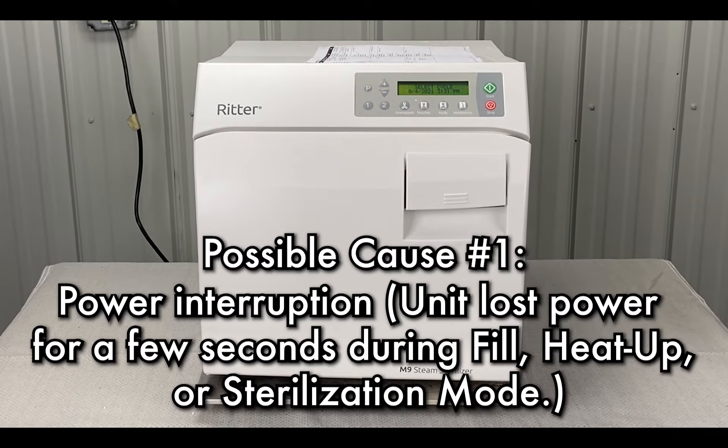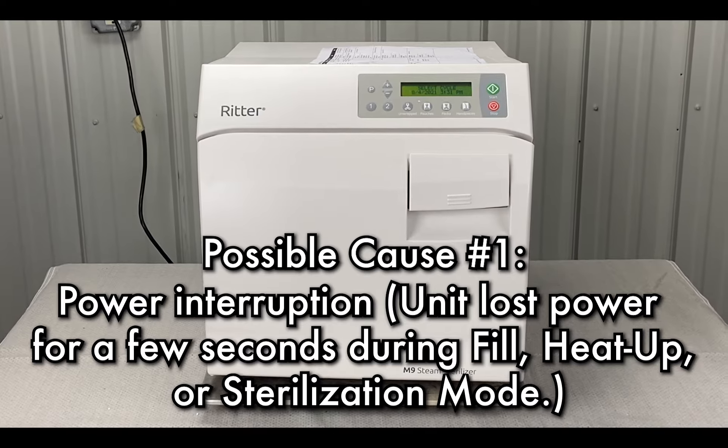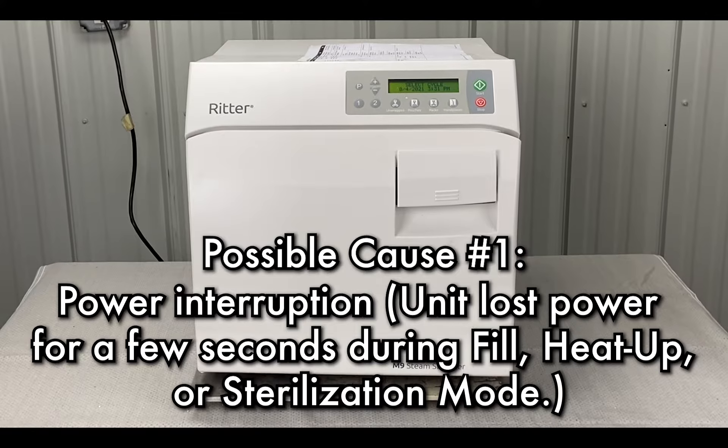The cause could be a power interruption — the unit lost power for a few seconds during fill, heat up, or sterilization mode.